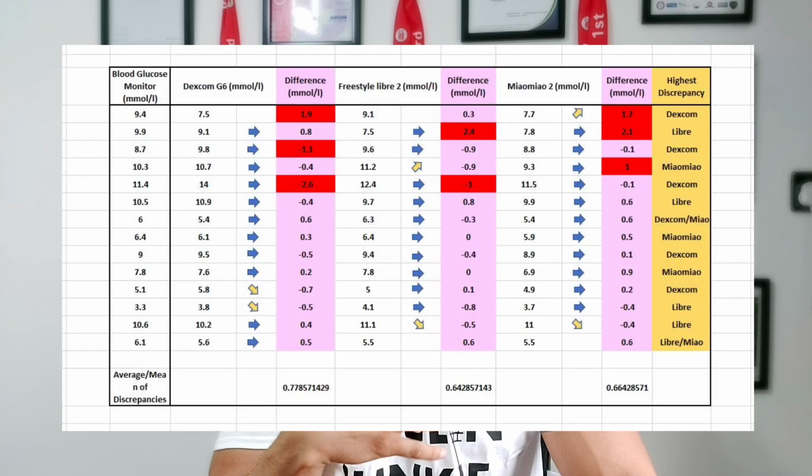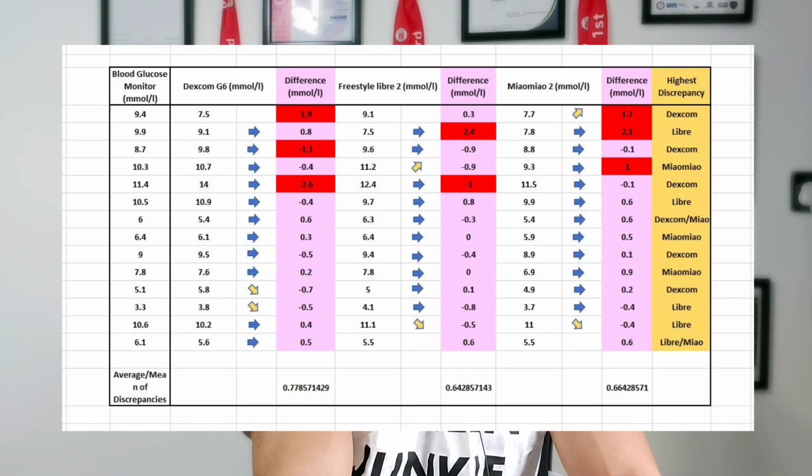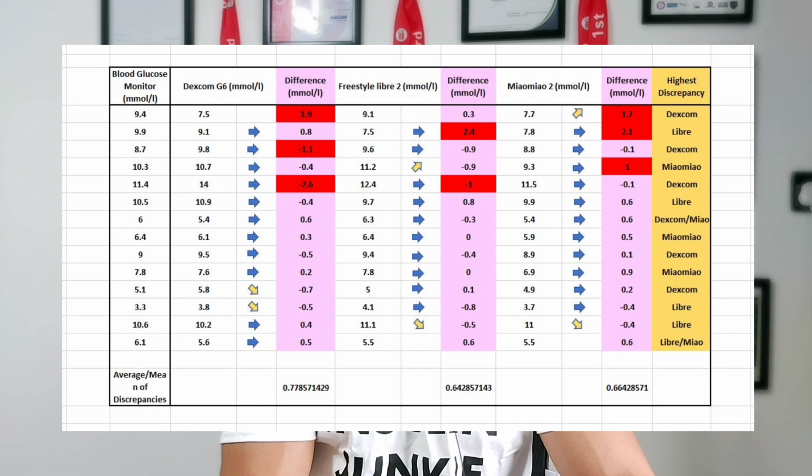But in my opinion, overall, if you go down at the bottom and you look at the average discrepancies, you'll find that DEXCOM is like 0.7, LIBRE is 0.6, MIAOMIAO is 0.6. To me, that's nothing. So if I measure my blood glucose and I see it as 6 millimole per liter or 6.6 millimole per liter, whatever I'm gonna do is gonna be the same. So let's say, for example, if it's 14 millimole per liter or 14.6 millimole per liter, I'm gonna do the same thing to fix it. I'm not gonna take an extra unit to adjust for that 0.6 millimole per liter.